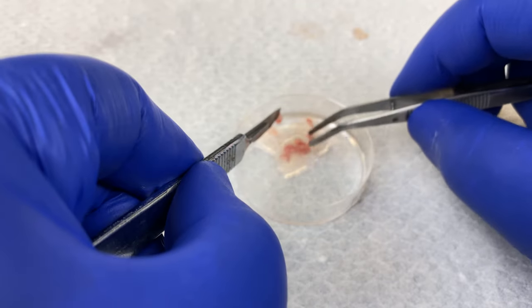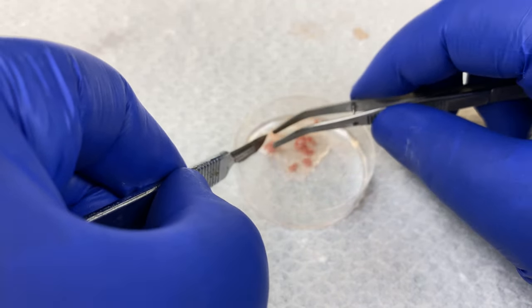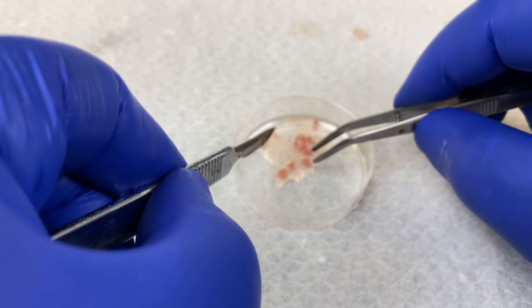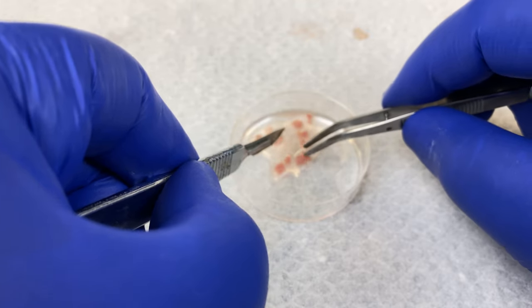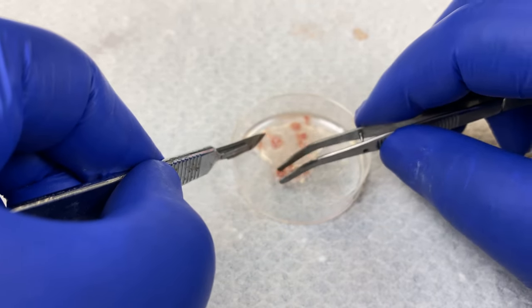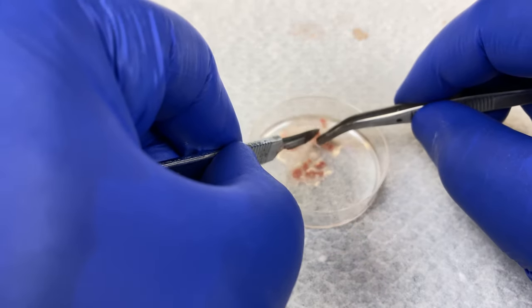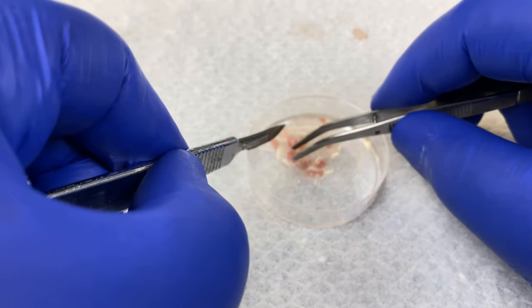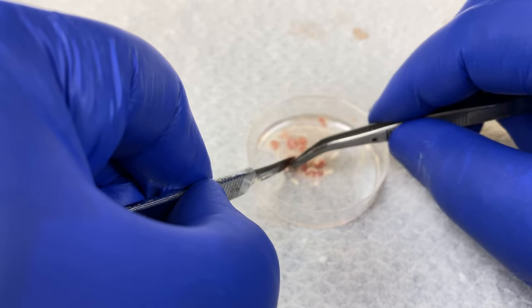The second method is cold trypsin. We'll keep our trypsin in the fridge until we need it. We'll put the small chunks into a conical tube and let the cold trypsin infuse into the tissue overnight. Finally, we'll do mechanical disaggregation — we will literally squish the tissue through a sieve to mechanically break apart the cells.